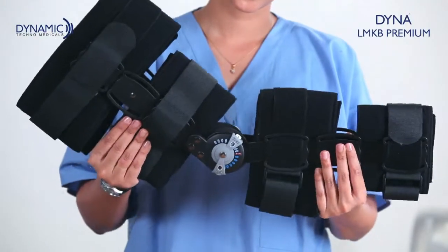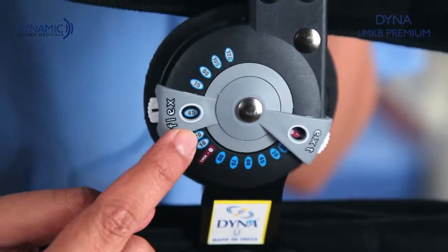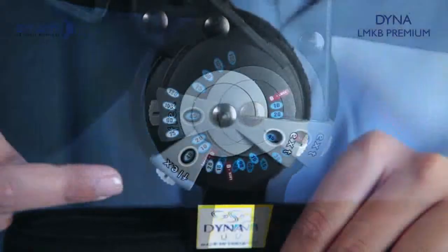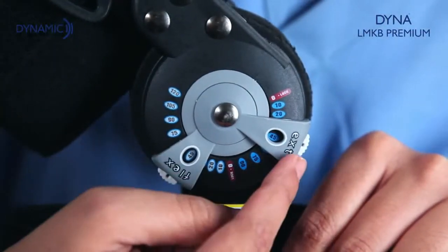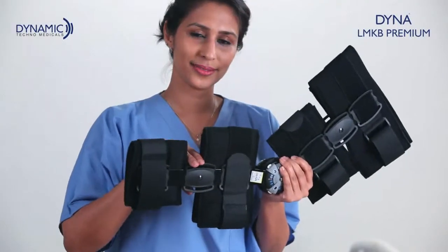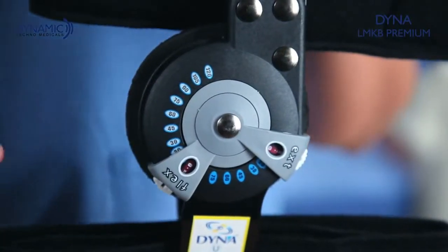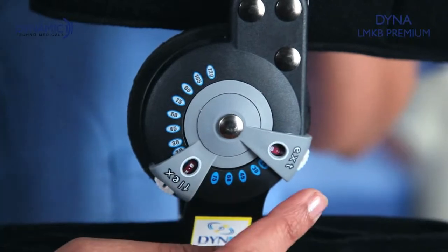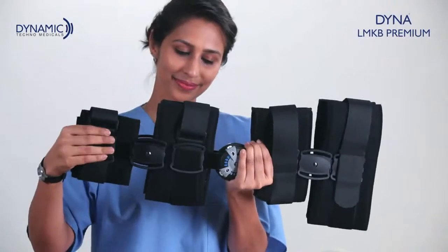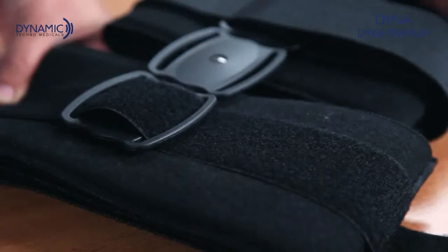Three example conditions: One — to provide a 45-degree range of motion, fix the flexion button at 45 degrees and the extension button at zero degrees. Two — by keeping both flexion and extension at 45 degrees, you can lock the knee joint at 45 degrees. Three — for complete immobilization, keep both flexion and extension buttons at zero degrees. These adjustments must be done equally on both sides. Velcro straps allow adjustment for optimal fit.